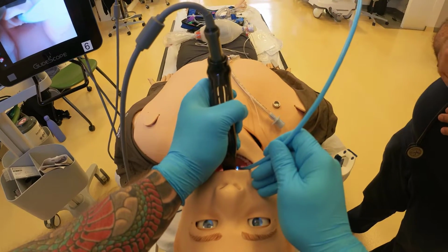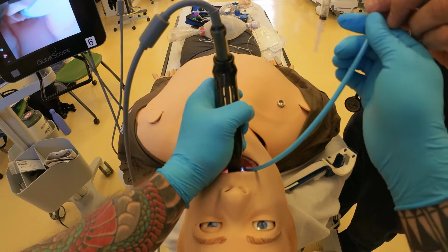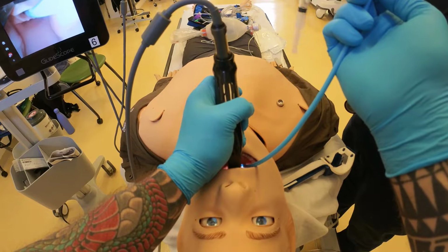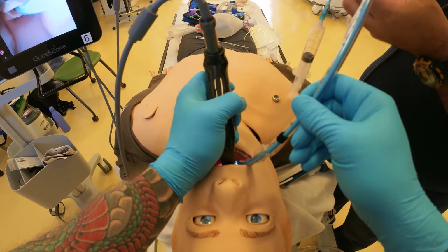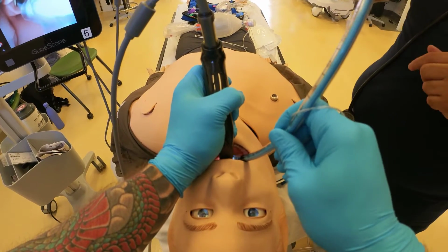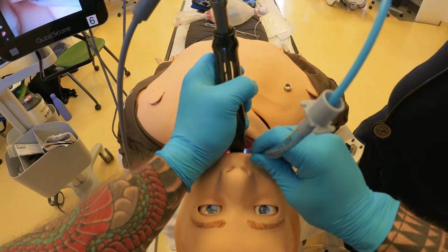And then my partner is going to introduce the tube over the top of the bougie. You notice if the tube is upright, this tip here may get caught on your vocal cords. So we're going to turn it counterclockwise once we pass it, right? So grab the top, right? So here, I come in, right? This is where I was talking about may get caught, counterclockwise, and it's easy insertion, right?